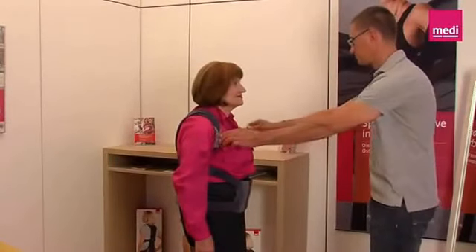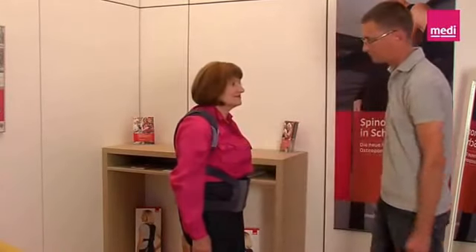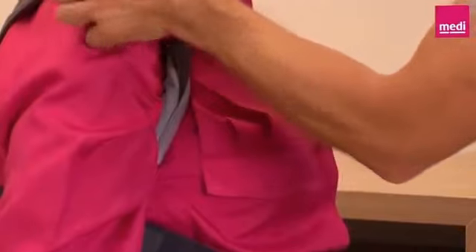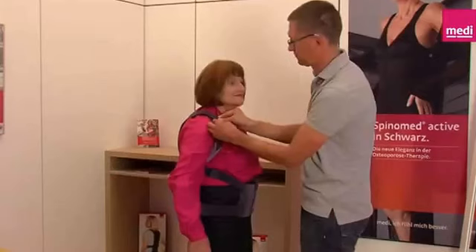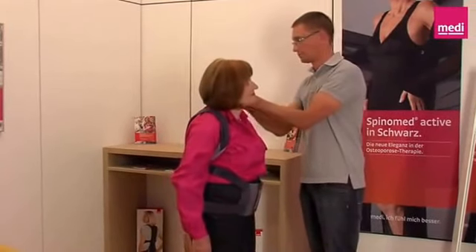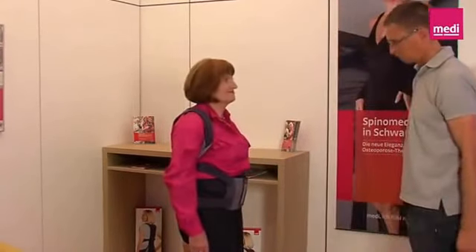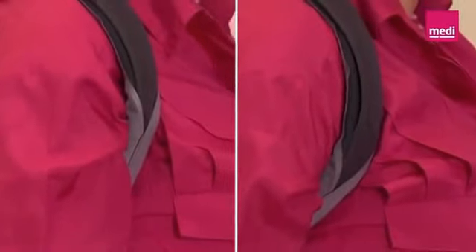Now check whether the shoulder pad is positioned correctly. To ensure that the brace will be comfortable for the patient, the V-shaped cutout of the light grey strap cuff should be located at the base of the armpit. To do this, open the Velcro fastening on the inside of the strap and position the shoulder pad as desired — do this on both sides. On the right you can see the shoulder pad is positioned correctly; on the left it is too high.